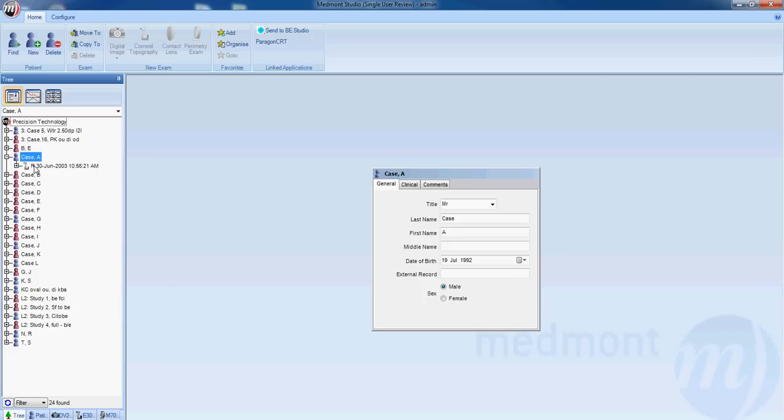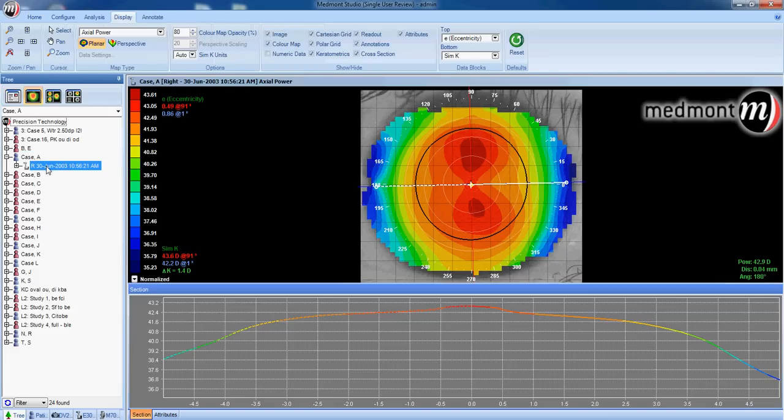In opening up the file we can see that there is one right topography inside that file. If you click on that topography, it will be dropped on the main active window here.